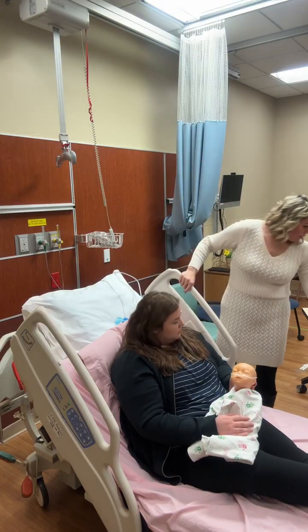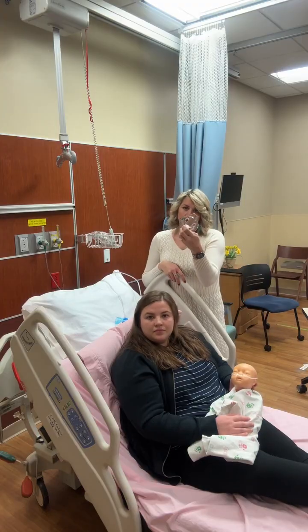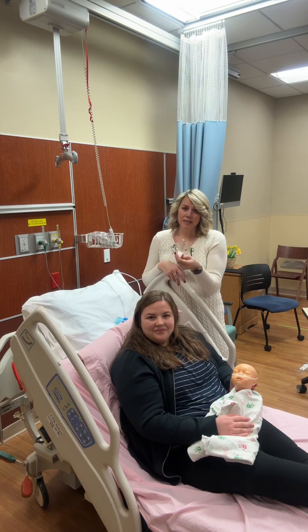Okay, so the next thing you might be thinking is maybe a mask. Okay, this is an adult mask. We do have infant masks. I couldn't find it, but we do have infant masks. We do have pediatric masks.